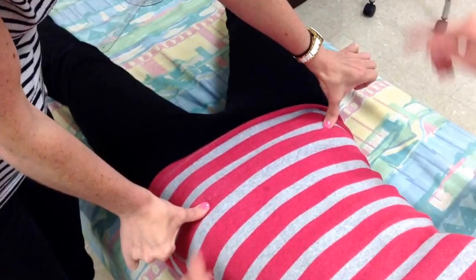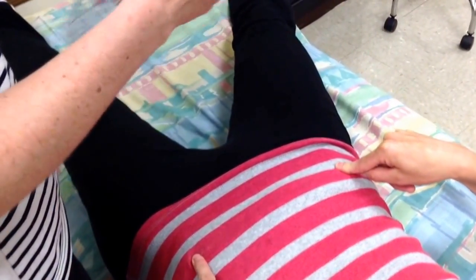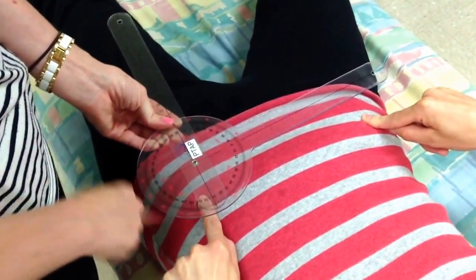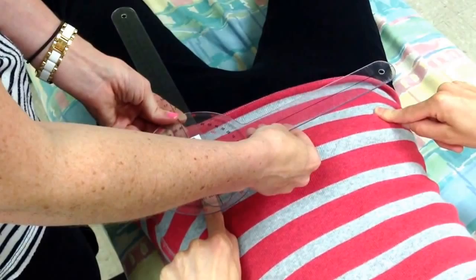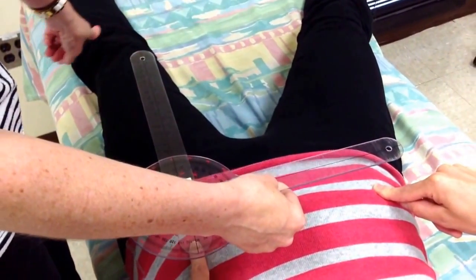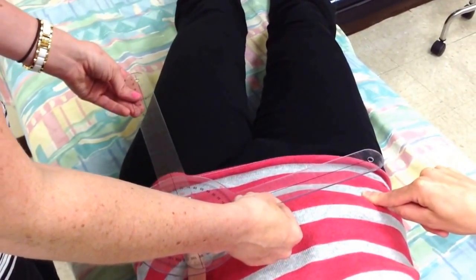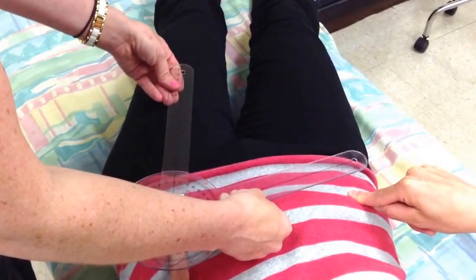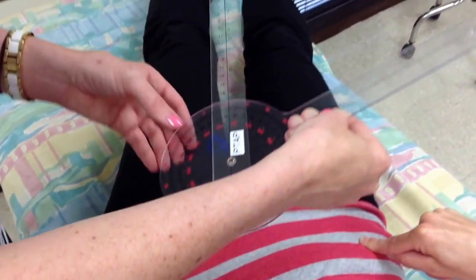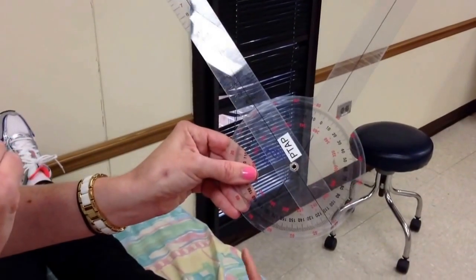I'm going to palpate those two bones that stick out in your hip again — would you put one finger on each of those? This time again, my fulcrum is over the ASIS of the hip that I'm testing. The stationary arm goes to the contralateral ASIS. I want you to keep your toes and kneecap pointed straight up to the ceiling and bring this left leg in toward the other one as far as you can — keep it down on the bed so we don't want her flexing too much. I move my moving arm so it's lined up with the anterior midline of the patella. Suzanne has 24 degrees of hip adduction on the left.